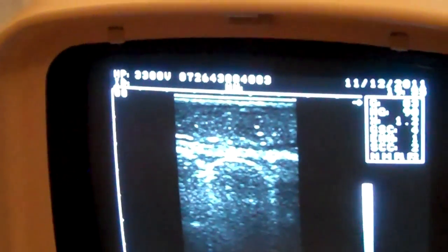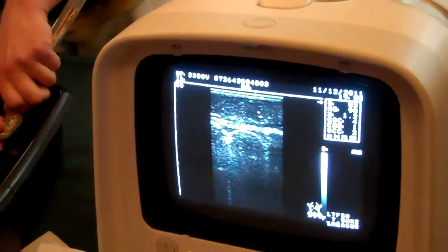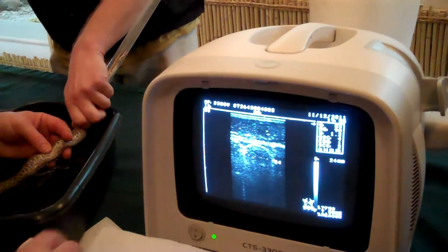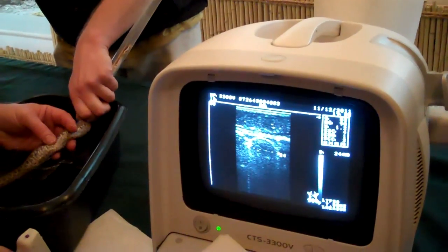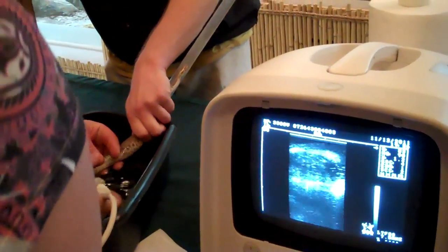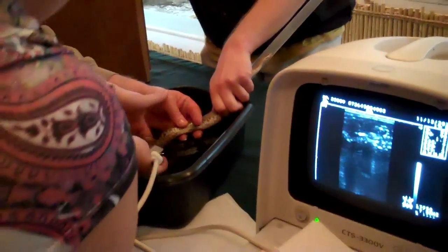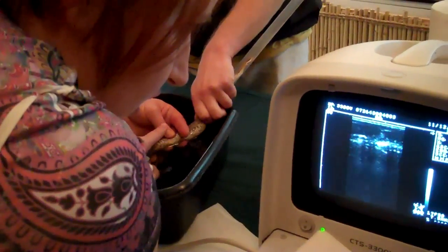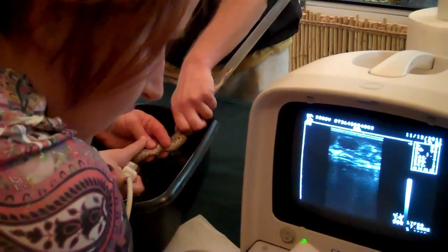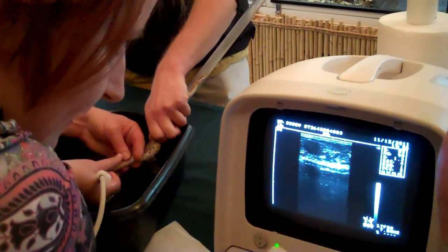I froze it. Do you want to see how many, or do you want to just see? So these are follicles. She's still pretty, I mean, she's going to be gravid. So she's at 24 millimeters. Okay. Well, I would have thought she'd be further along than that. Yeah. I also heard that they have extremely long gestation periods too. Okay, I'm trying to picture it. Can they still absorb at that size? Is it 24? That's a good question. 24 millimeter in that animal.